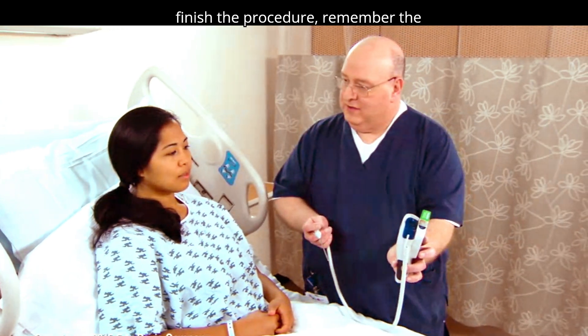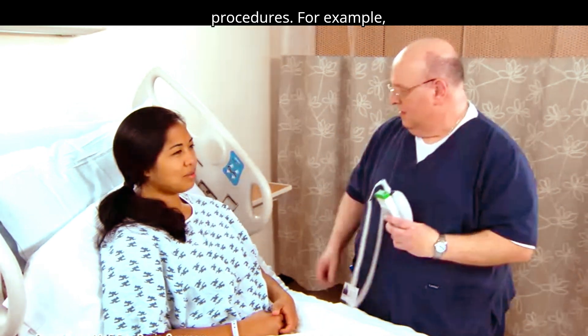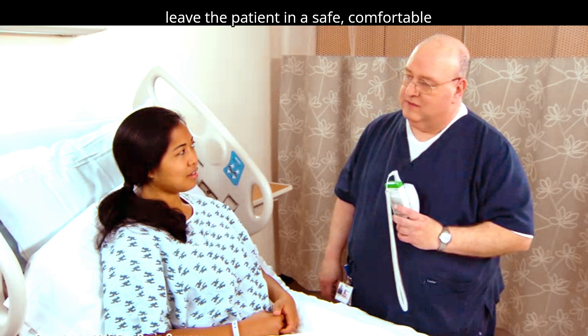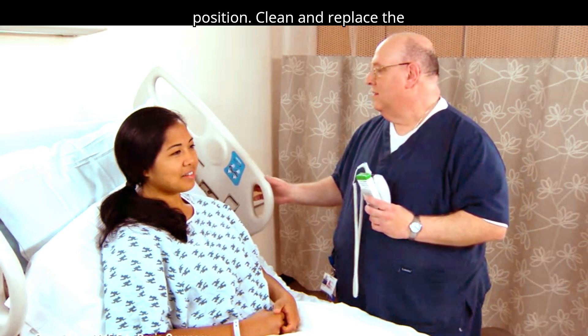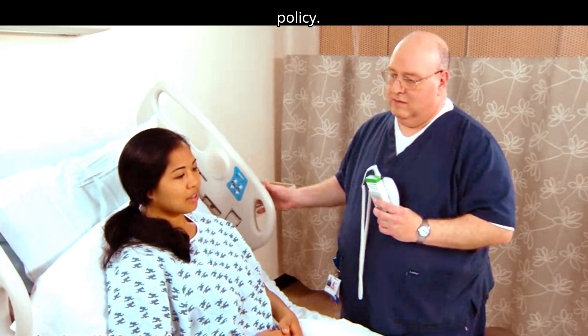When you finish the procedure, remember the universal steps that apply after all procedures. For example, leave the patient in a safe, comfortable position. Clean and replace the thermometer according to agency policy.